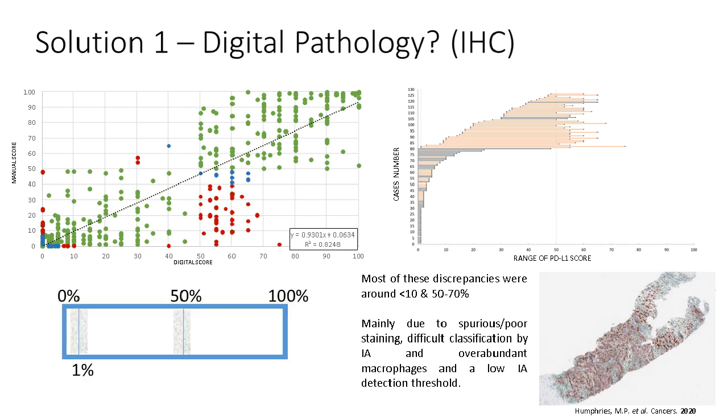And this was where we were actually unsure what the ground truth was. And this is because the subjective nature of the assessment of PD-L1 is extremely difficult. So we could have a pathologist that comes along and says the ground truth of this case is 53%. So that is in the high category. The patient would get the first-line therapy.